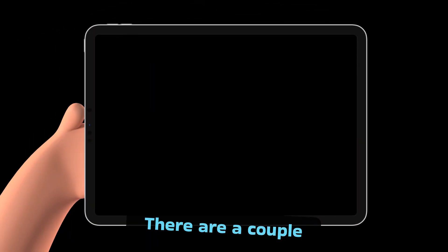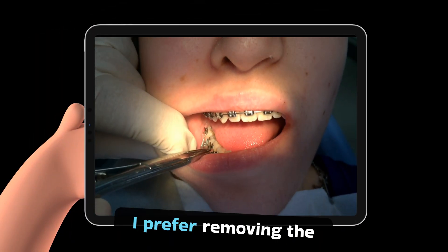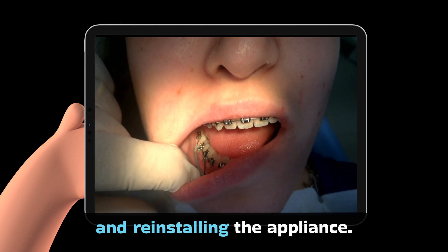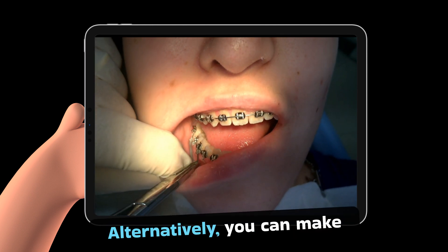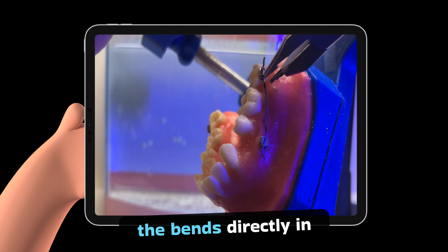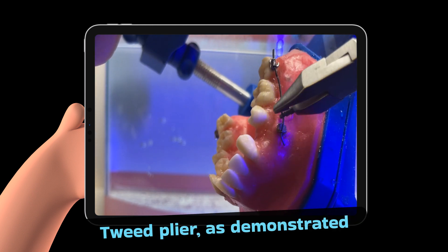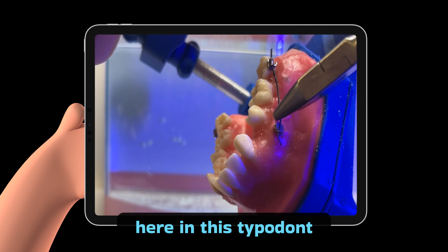There are a couple of approaches to consider. Personally, I prefer removing the spring, repeating the bends, and reinstalling the appliance. Alternatively, you can make the bends directly in the mouth using a tweed plier, as demonstrated here in this typodont simulation.